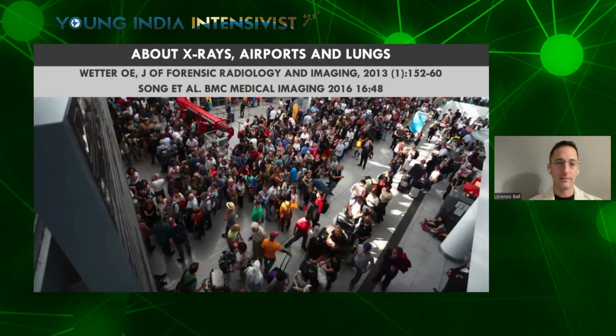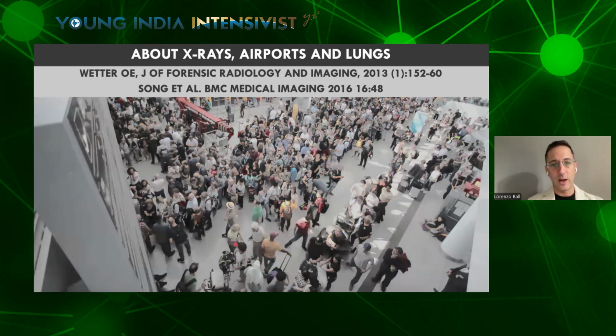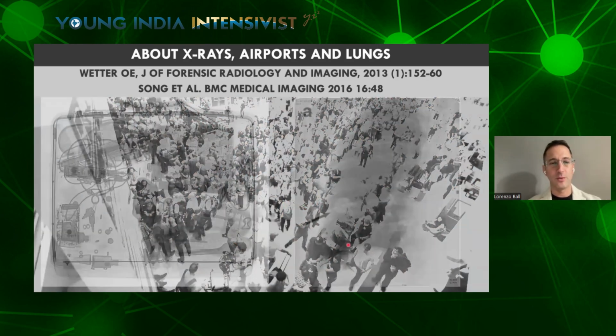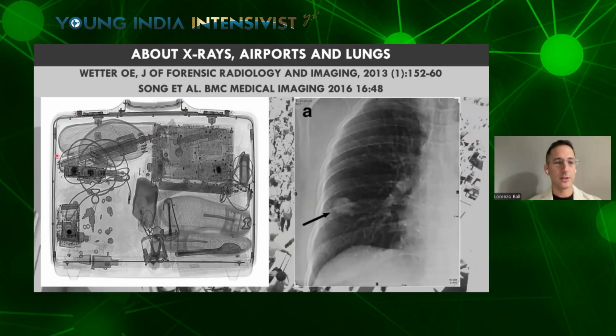I always give this example. This is a picture of an airport. And this is a picture of an airport taken in black and white. Of course, we have much less information from a black and white image. And if you go through the security checks of an airport, you will see an image like this. And if you perform a black and white chest scan with an X-ray, you will get a black and white image. But actually, those of you that are frequent travelers will probably have noticed that security scanners give a color image.